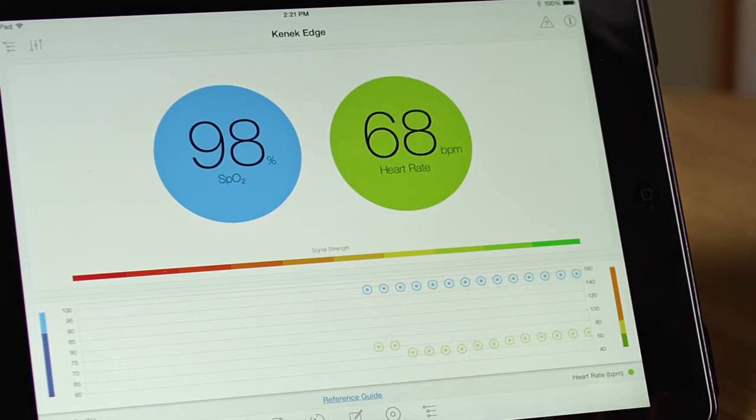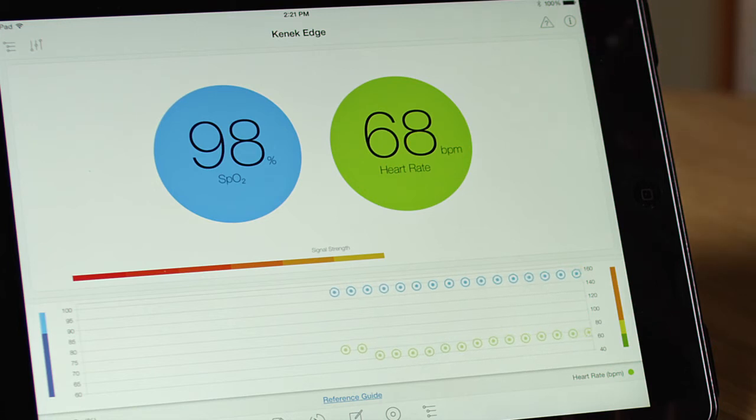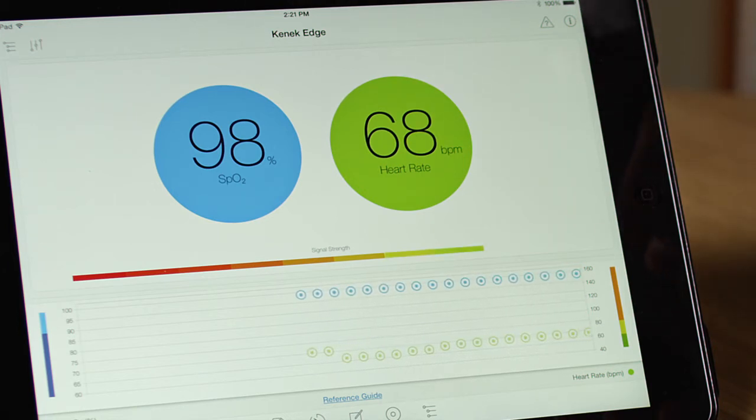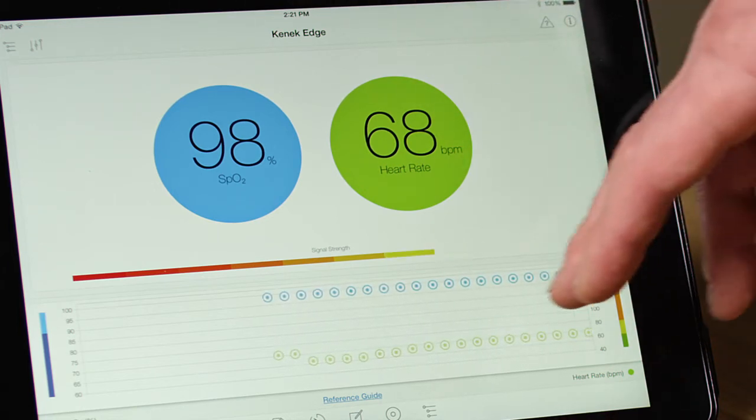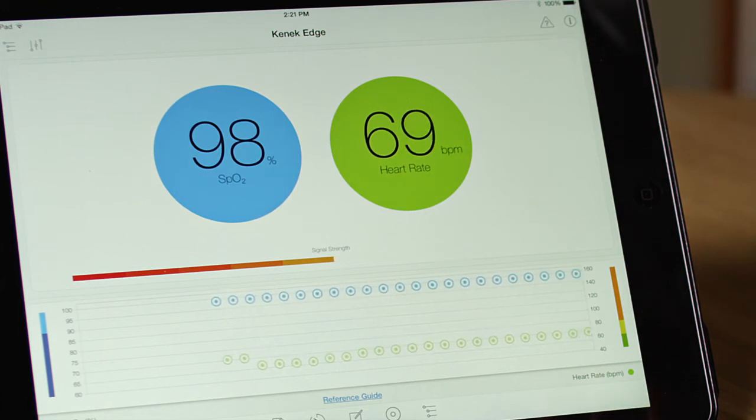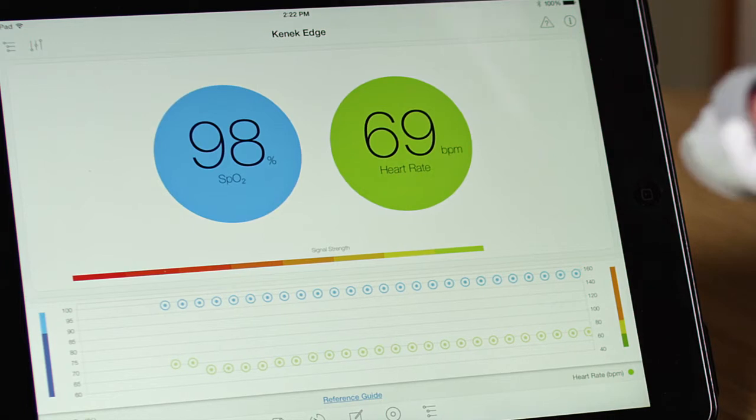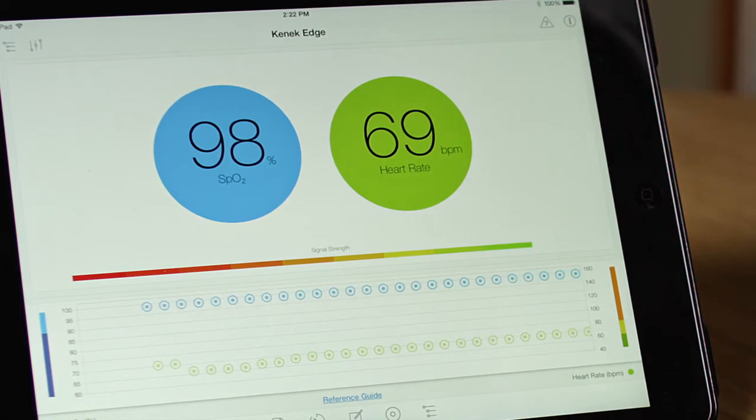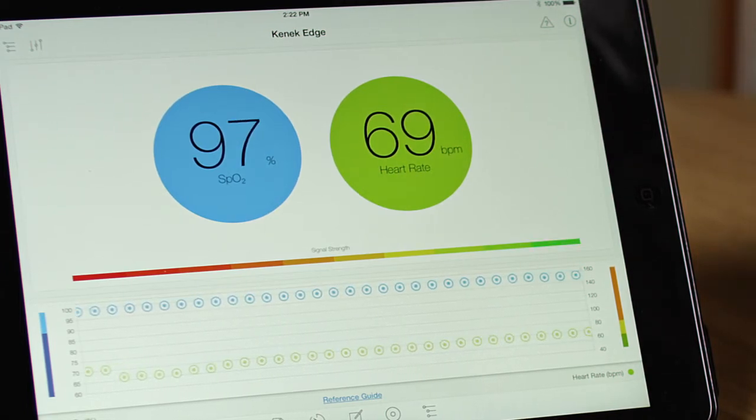So typically the SpO2 values don't change very much. Heart rate may change and the real-time graph at the bottom captures those changes over about 30 seconds. What you can also see down here in the rainbow-colored bar is the strength of the signal. This shows how well the test is being run on my finger.